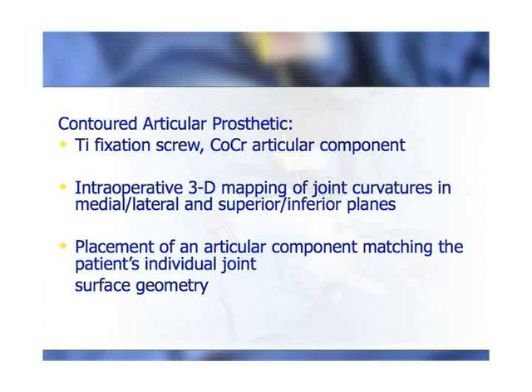Those surgical principles, though, become more important in the older patient, where biologics, as recent literature has suggested, aren't as successful. And unfortunately, with some of the older patients, their presentation is more frequent. And it's a very nice lateral transition to be able to use the Arthrosurface instrumentation employing these same surgical principles, because of the ability to intraoperatively 3D map the joint curvatures and match these perfectly and take advantage of the ability to basically fit the components to the patient.